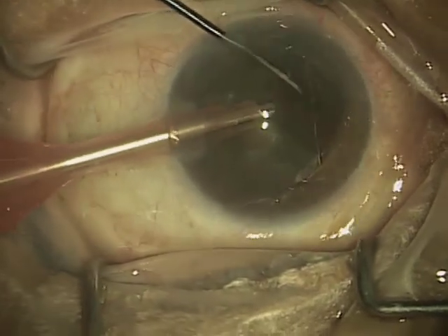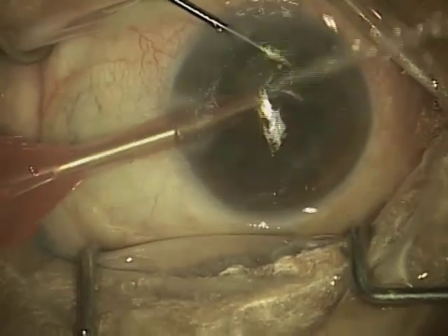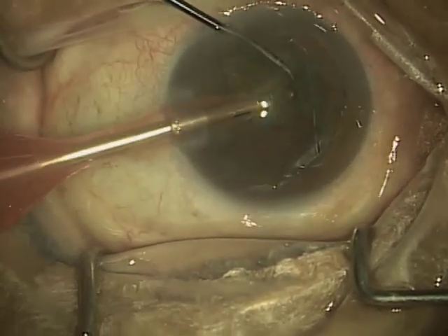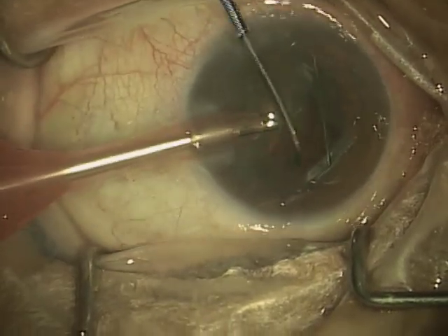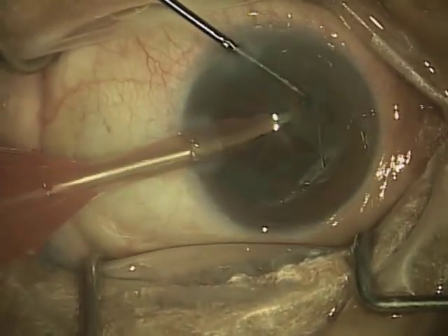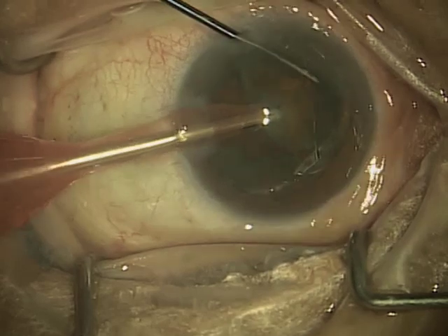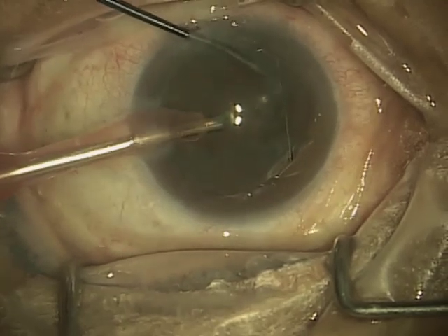This is really an incredible process and we have the late Dr. Charles Kelman to thank for that — an absolutely brilliant man who realized one day in his dental office that the same technology used for cleaning teeth could be used for removing cataracts. So how's that for thinking outside of the box?